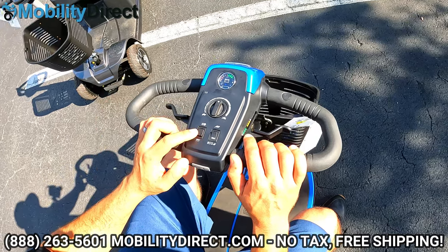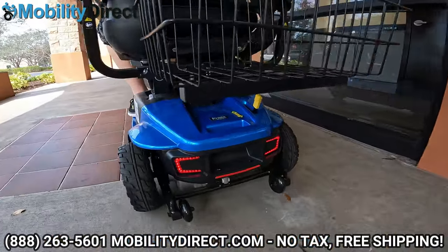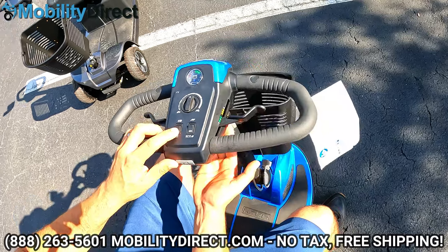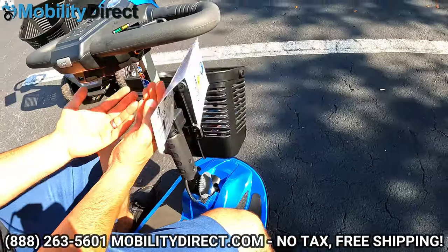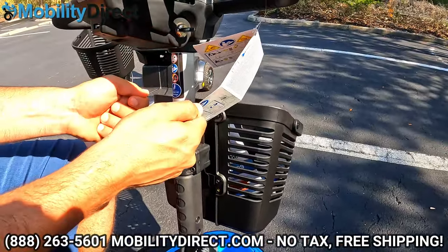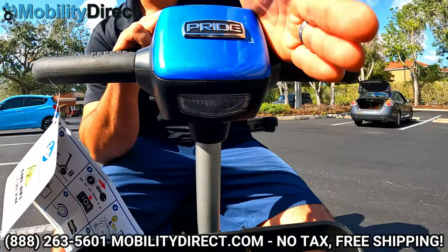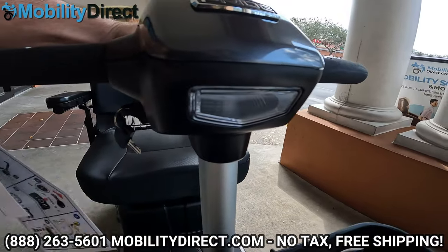The lighting kit is pretty impressive. You have running lights which act like brake lights — as soon as you let go of the throttle, the brake lights kick in. You have an under-storage light underneath the handlebar assembly, useful at nighttime for looking inside your pocketbook or wallet. You also have a headlight, which I'll turn off and on for you to see — it lights up the path in front of you.